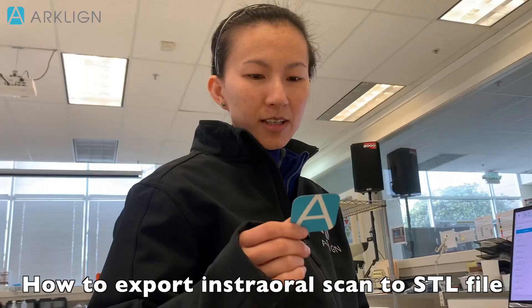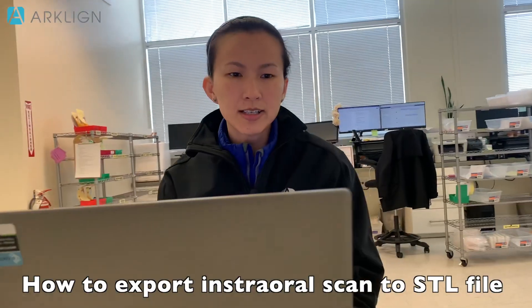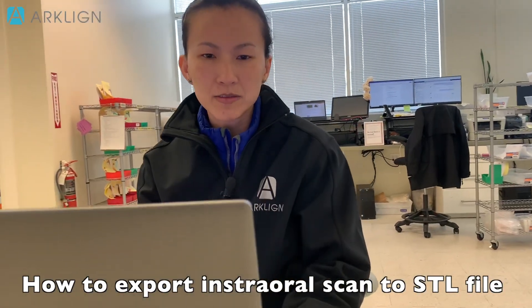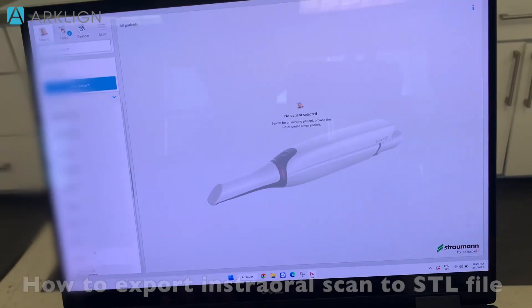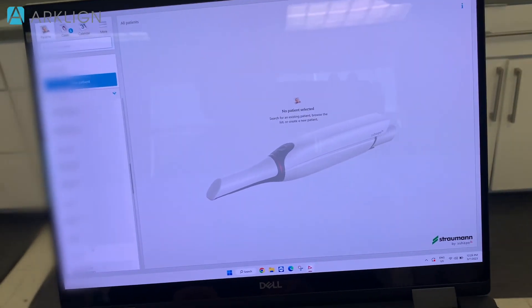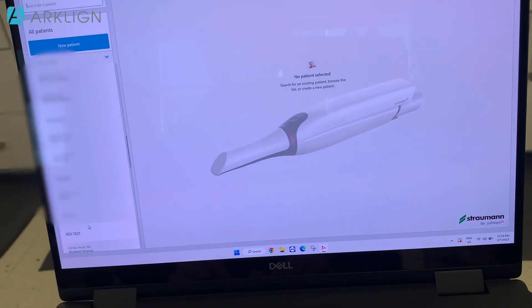What am I doing? Let me show you. We're exporting an STL file from the Trios. How to export STL scan from Trios.